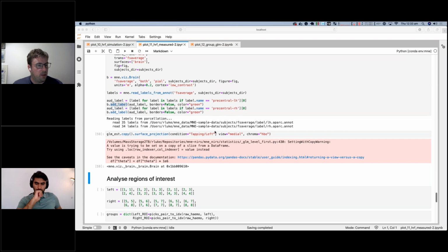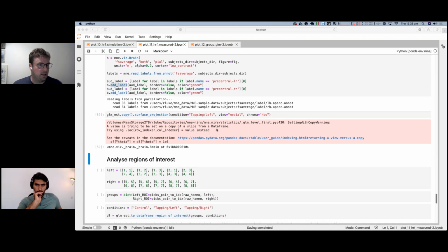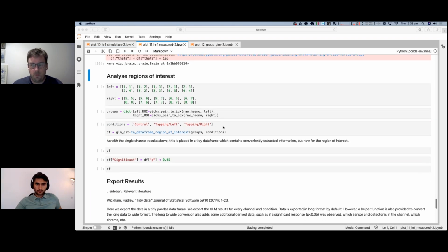Now I'll move on to how you would do your region of interest analysis with the fNIRS. Unless there were any questions that have come in before now. Nope, not at the moment. Good. Okay.